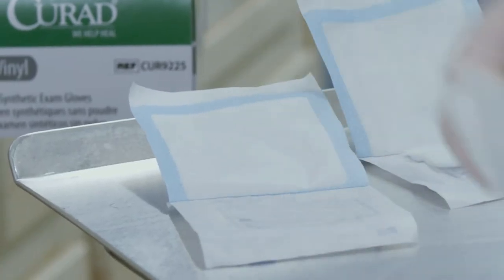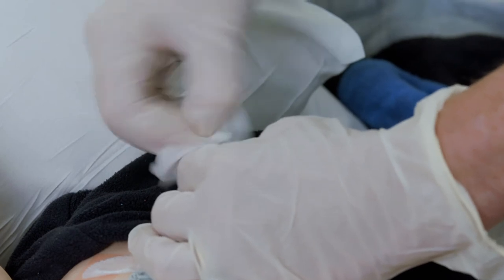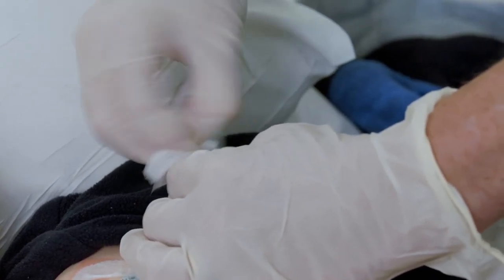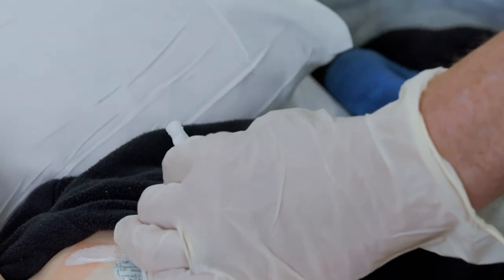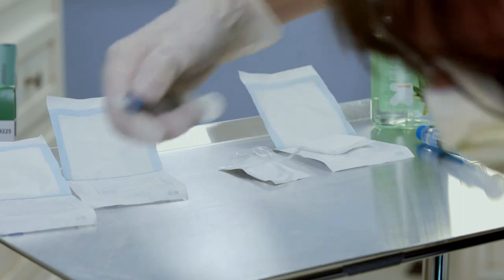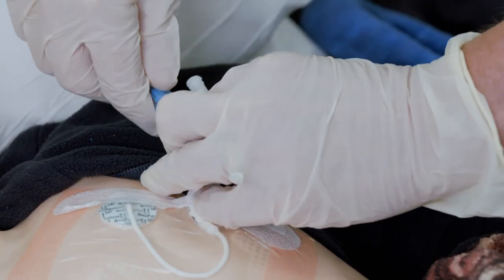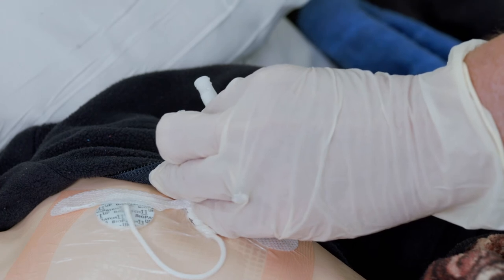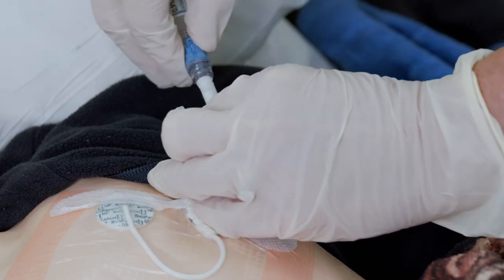Scrub the end of the line with the new gauze and alcohol pad for 15 seconds. Let it air dry. Continue to hold the line while you pick up the normal saline syringe with the new Needless Connector attached. Use the other hand to remove the plastic tip. Screw the new Needless Connector onto the line.